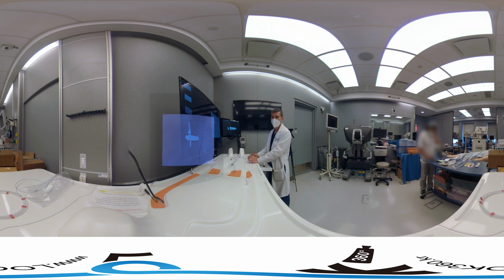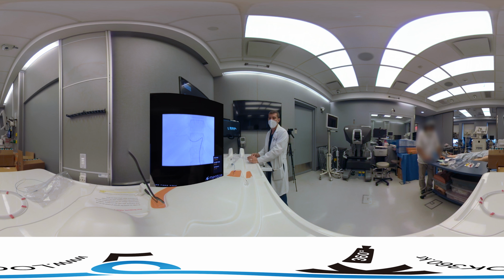So for this portion, we're going to start delivering the embolic agent to the tumor. We have a couple different options. We can do conventional TACE. That's where we deliver chemotherapy, usually doxorubicin, in combination with Lipiodol, which is an oil, and an embolic. And we usually mix that into an emulsion and deliver it that way through the microcatheter.